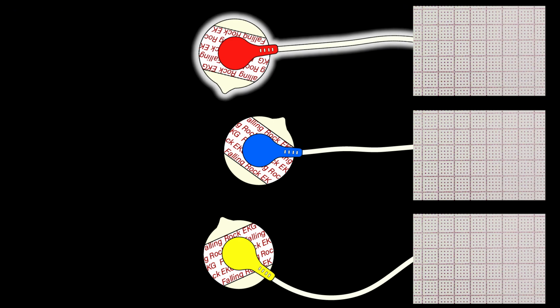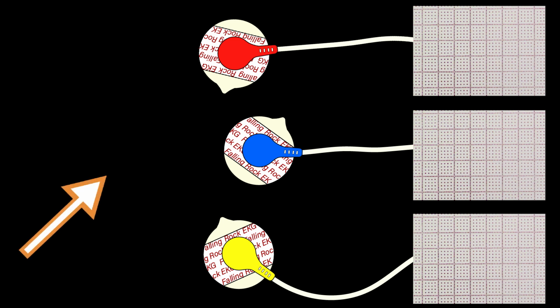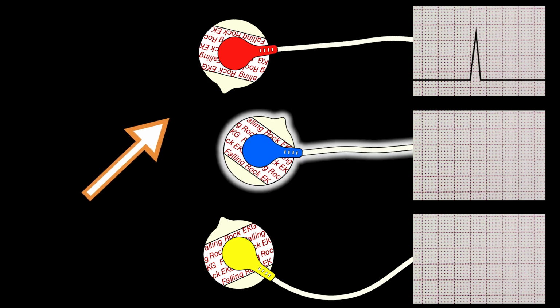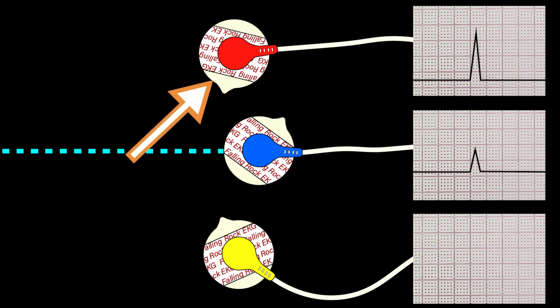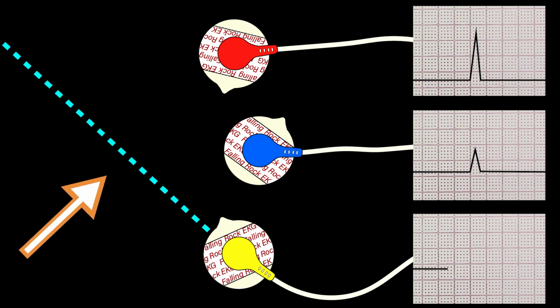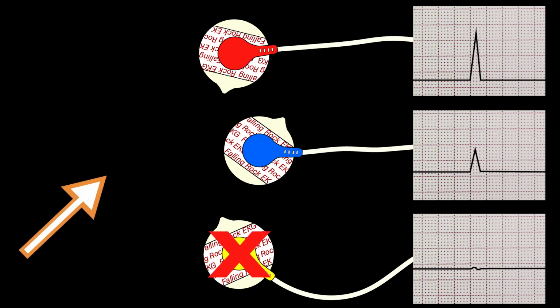Here we have a red electrode, a blue electrode, and a yellow electrode. If a depolarization moves directly towards the red electrode, then it will record the largest deflection. Let's watch that again from the blue electrode's point of view. Notice that the arrow is pointing at a 45-degree angle to it. Because the depolarization vector doesn't face it directly, the blue electrode will record a smaller deflection. The yellow electrode is at a 90-degree angle to the vector, and it hardly detects anything at all. The vector isn't pointing towards it, so the electrode doesn't see it. Electrodes are best at measuring waves that come directly at them.